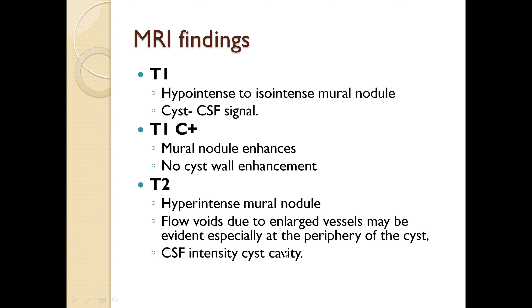On MRI, on T1, the mural nodule is hypo to iso-intense and the cystic cavity is of CSF signal intensity. On post-contrast T1-weighted images, there is enhancement of the mural nodule but no enhancement of the wall. On T2, the mural nodule shows hyper-intense signal and we can sometimes see flow voids due to the enlarged vessels at the periphery of the cyst, as we saw in our case. A CSF intensity cystic cavity is also seen.